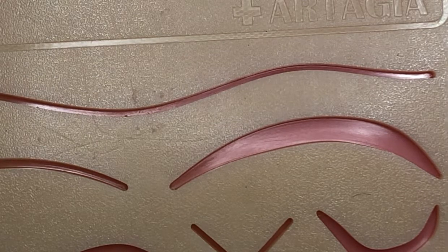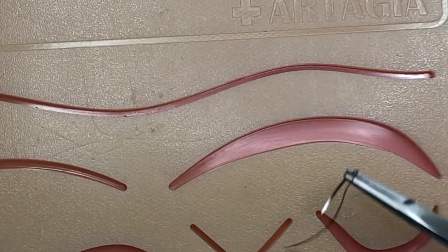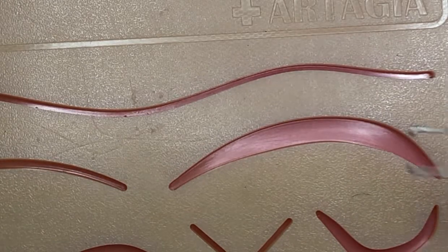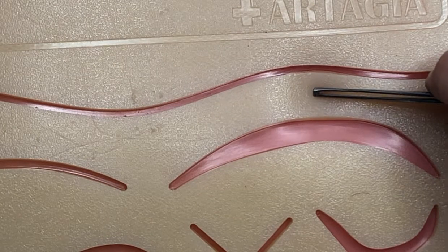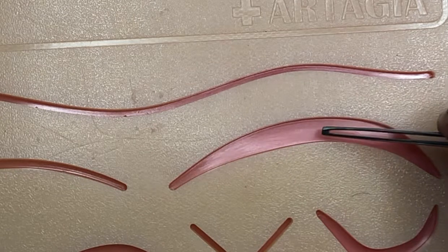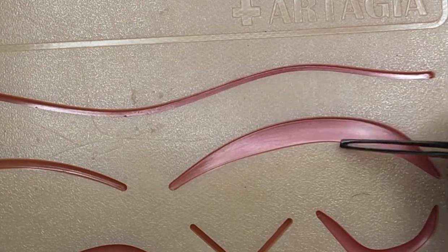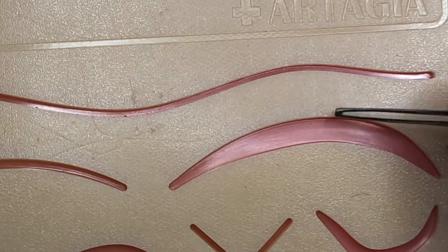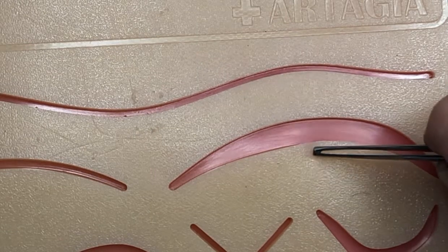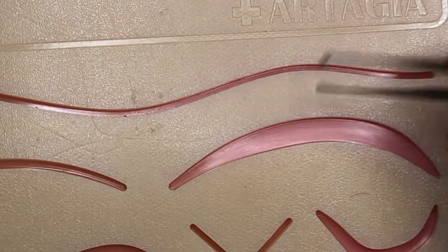Another way to think about the vertical mattress suture is the far-far-near-near. What you're going to do is enter the tissue far and come out far, then go back near and come out near. It's deep and far, then come out deep and far, then go in near and more superficial, then come out near and superficial, and then you're going to be tying the knot right over here.